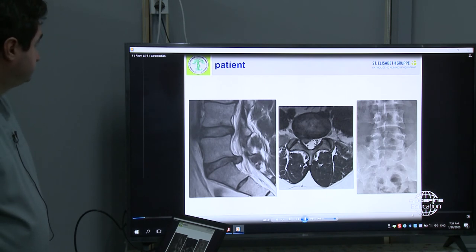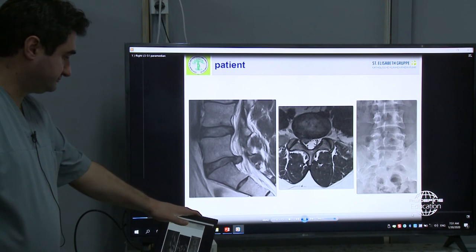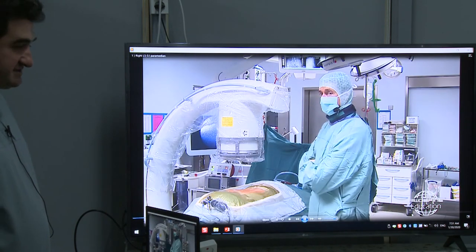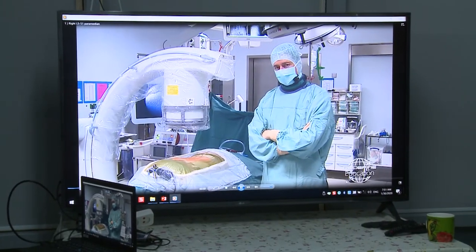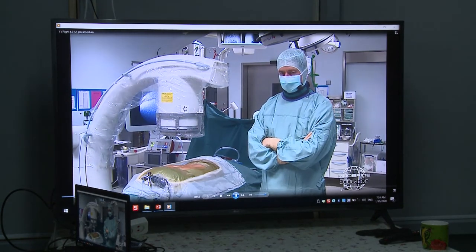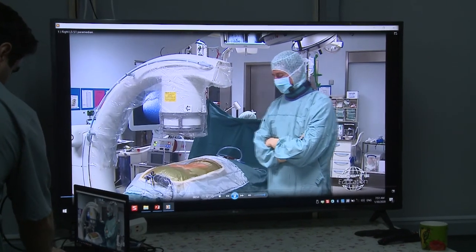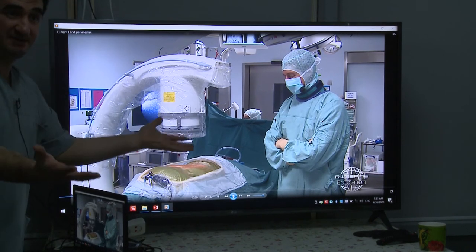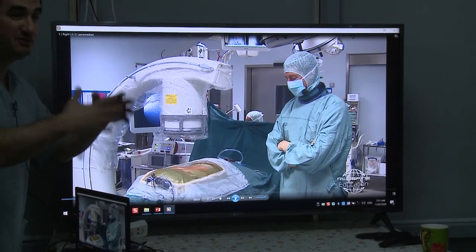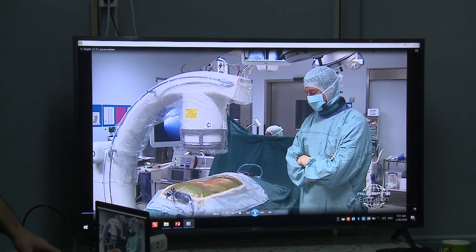Especially, we should look for the interlaminar window in the AP radiogram. Okay, we can follow the operation. From the imaging, it's Dr. Rutten from Harney, a standard case, L5S1. But you can say it only after the operation if it was an easy case or if there were difficulties. I would like to mention a little bit about this one: there is a bag connected with the drip. The water goes into the bag and you can put suction on it. It's very useful for endoscopic operation.